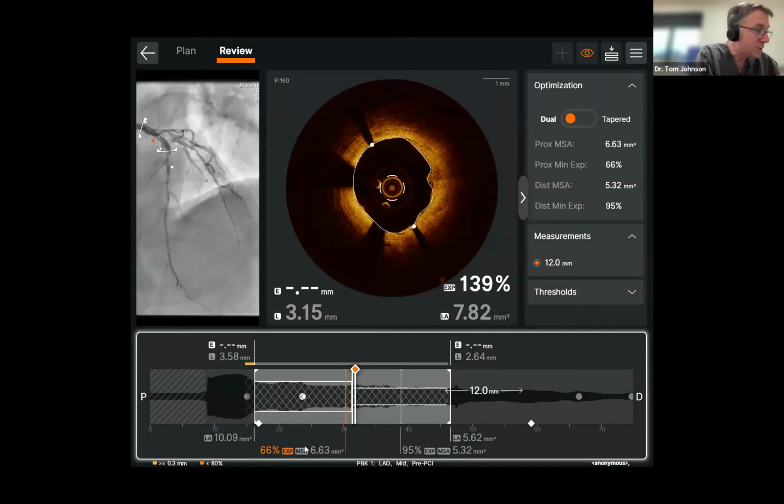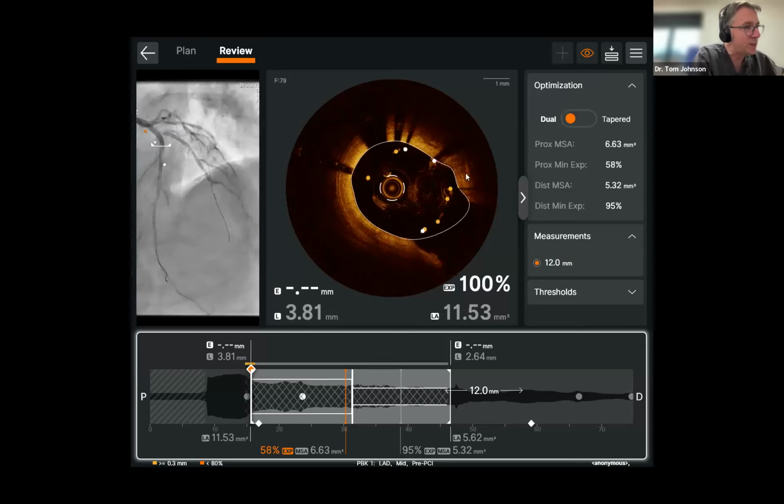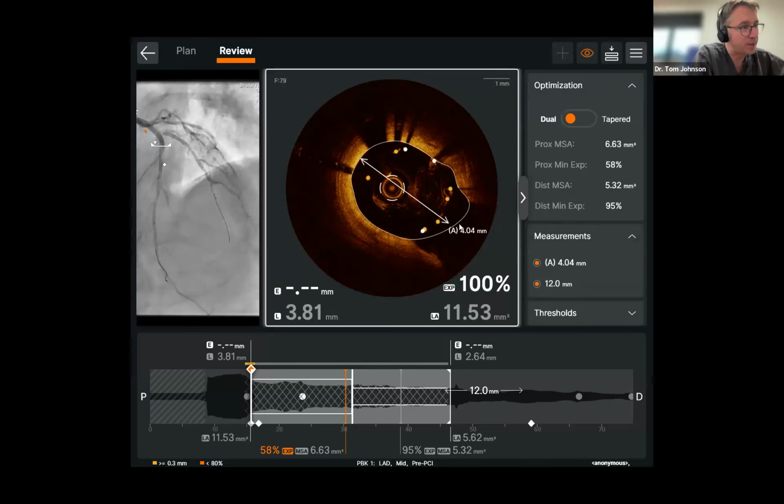Sorry. So this is telling us that if you divide it in half, the luminal area is picked out for the segment. We take it from here. We can see quite clearly on this still frame that we still have marked malapposition of our stent struts. And actually this vessel is measuring closer to 4 millimeters, so certainly in one plane, this stent needs to be expanded to 4 millimeters, where I'd taken a 3.5.